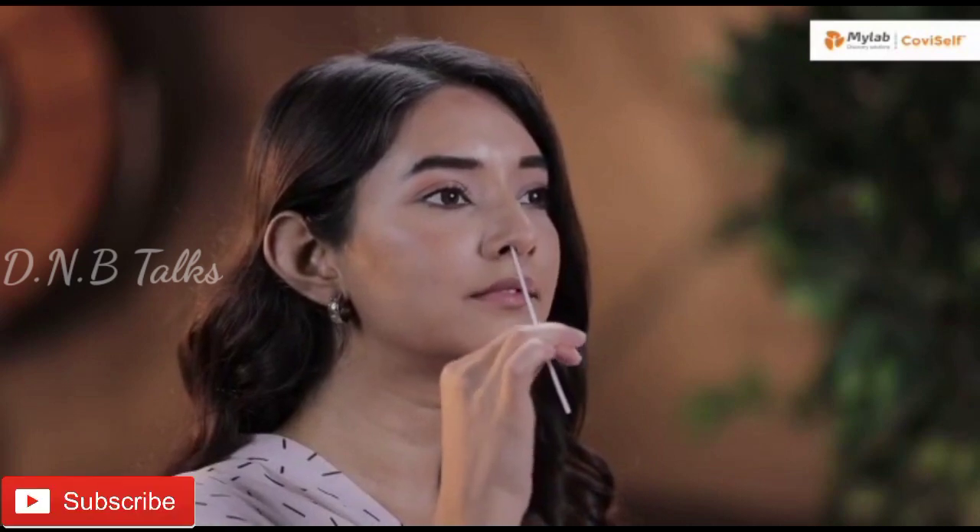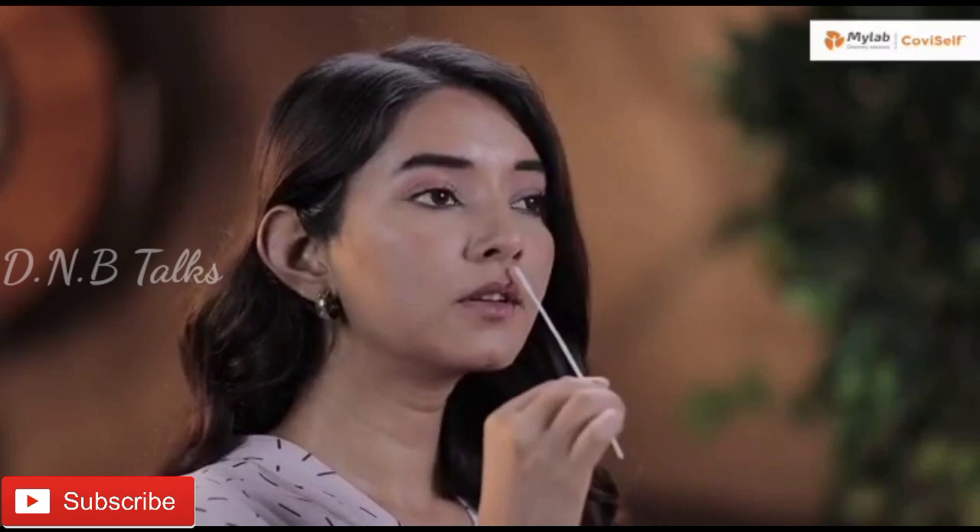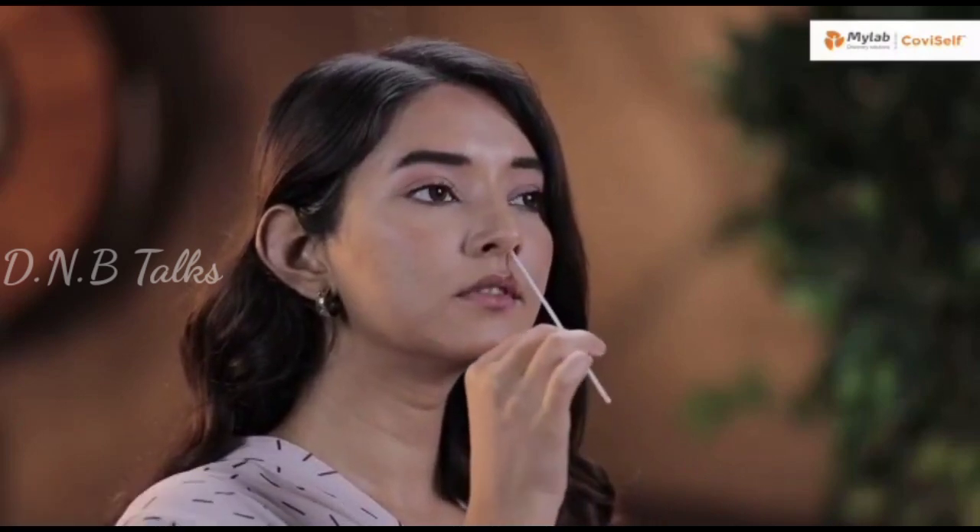Carefully insert the sterile nasal swab in both your nostrils one after the other, up to 2–4 cm or until resistance is met. Roll the swab five times inside each nostril. Your nasal swab is now ready for the test.